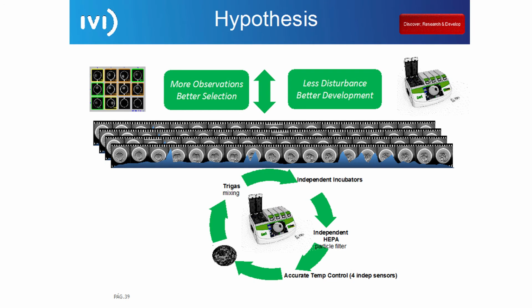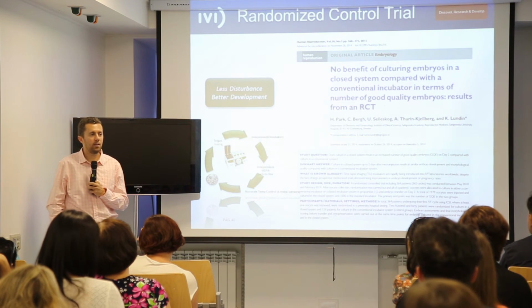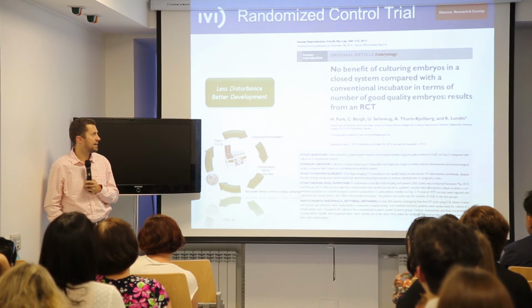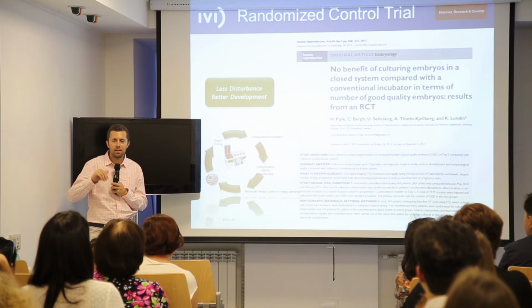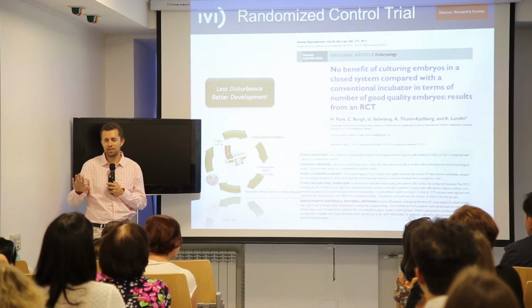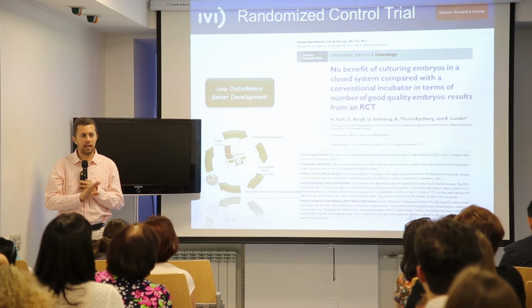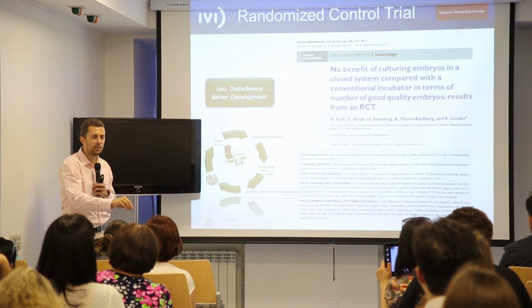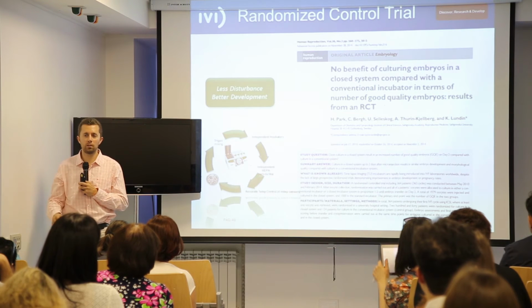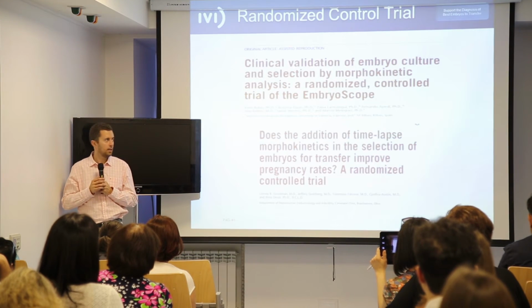Well, there are only 3 randomized control trials published. This one was just to compare the capacity of time lapse to improve the outcome. That was done in Scandinavia, in which they do transfer on day 2 only, so it's a very special situation. They compared using time lapse or not, not for selection, just for incubation. Just put your embryos in the time lapse or not, and take a look at the outcome. If you see the results, no difference at all.